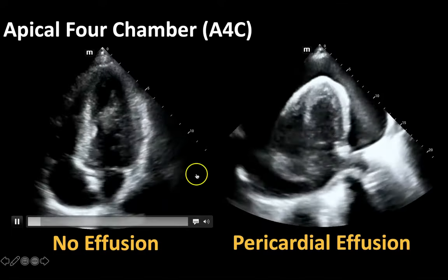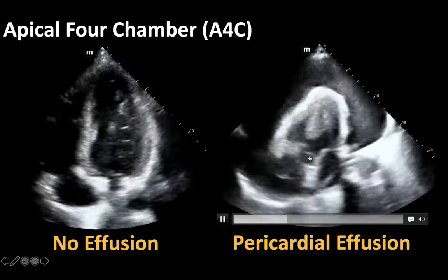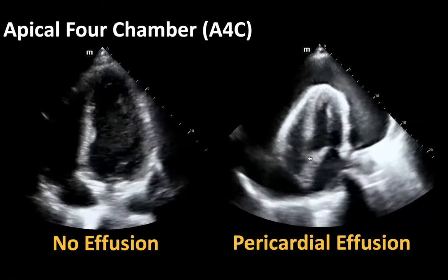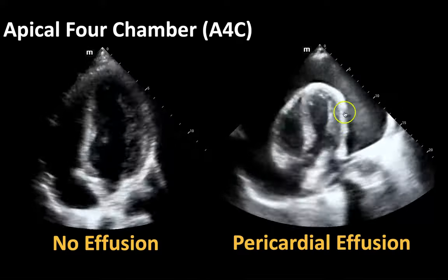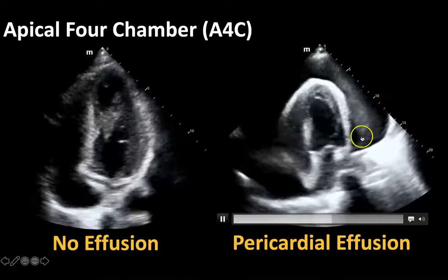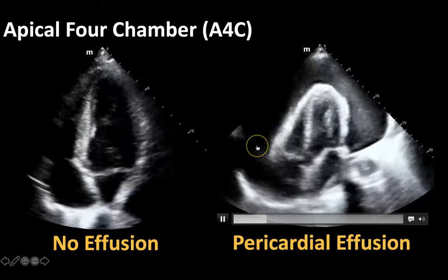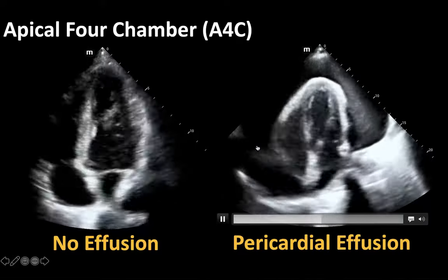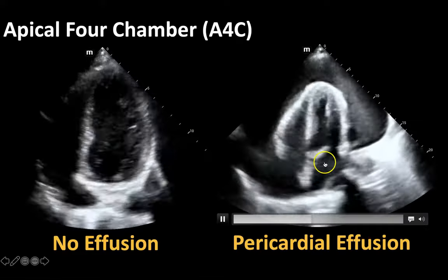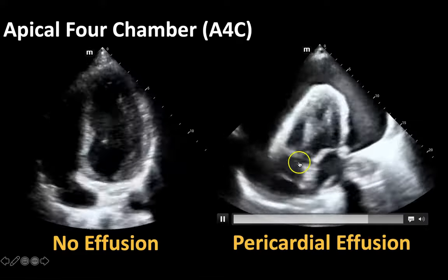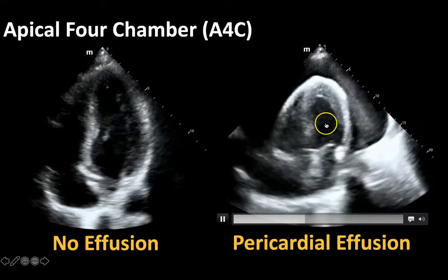This is in sharp contrast to the heart on the right side of the screen, which is the same study from the last slide — the same patient with this very large pericardial effusion, just looking at it from a different window. This is again your apical four chamber view, and you do see your four chambers here.